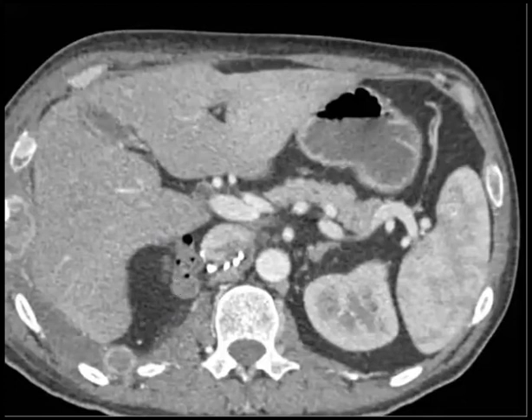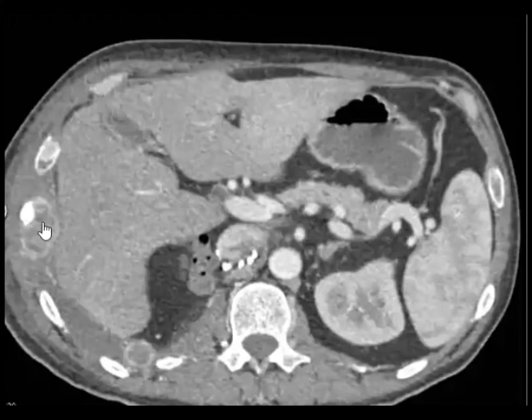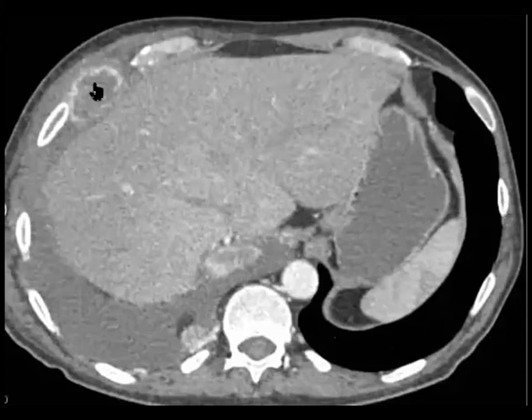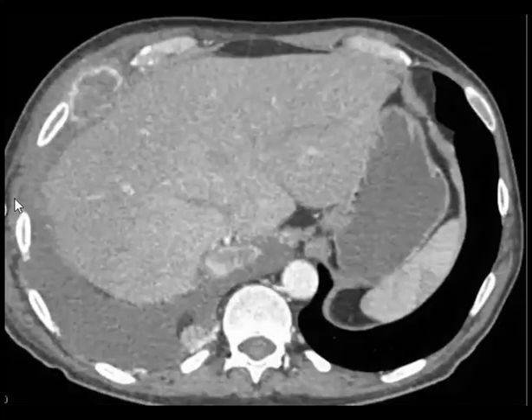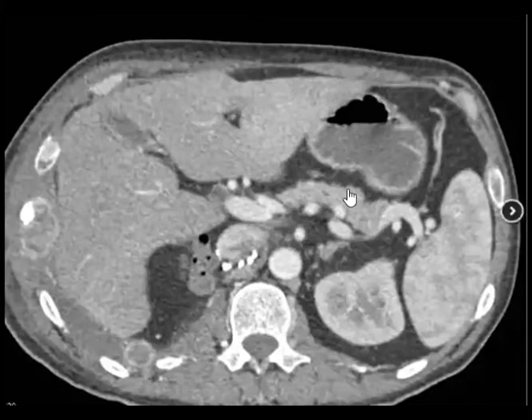And you remember that we mentioned that renal cell carcinoma can give everything. So you should search for bone metastasis, and also peritoneal or pleural metastasis. It is a hypervascular metastasis, so it can give you everything. I think in Radiopaedia there is one very nice case, and it is metastatic even to the pancreas as well, similar to this case.